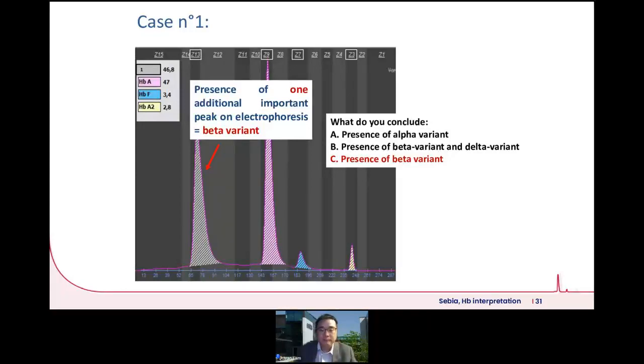Right. So remember that the shift in the beta variant position is not confined to only the left or the right, because it depends on the chemical change in the beta gene. It could be either direction. Right?